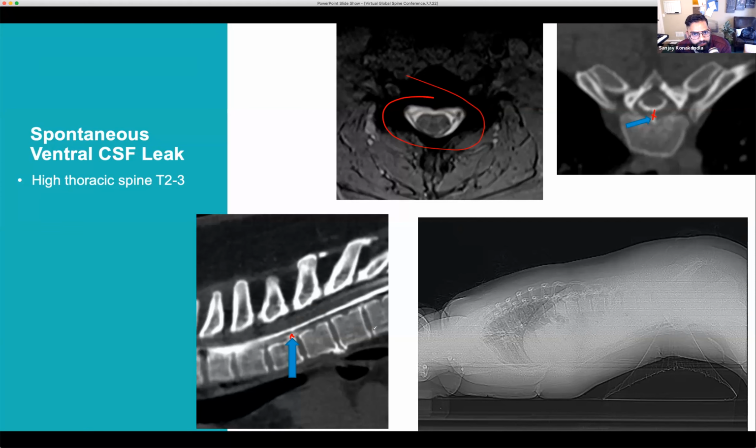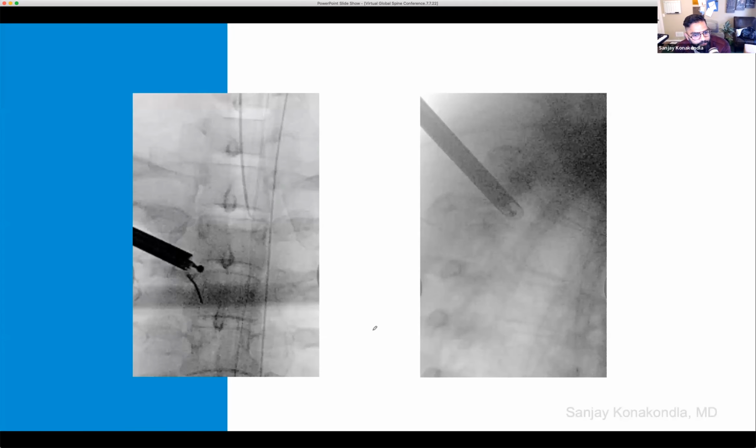We talk to the patient. Alternatives for this is obviously going to be your dorsal approach, laminectomy, intradural approach, retract and cut the dentate ligaments, turn the cord around and fix that ventral dural defect primarily, which we could always do, or we can offer the endoscopic approach, try it, see if it works, because again, to me, that's that half step, and we could still always offer that intradural open approach anyway. So that's what we did.